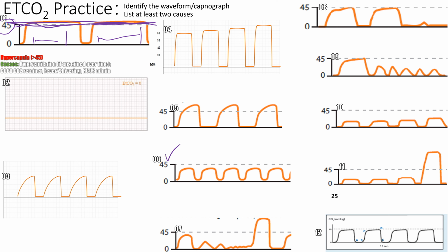This is bad morphology. So no hat, dislodgement. Yep, we got no hat here. Well, the teacup can still sit there, but that is not a good sign. We have a flat waveform. So what can that mean? Lack of ventilation somehow. They stopped. It became disconnected, the ET tube. What else? It could be dead. They could be dead.